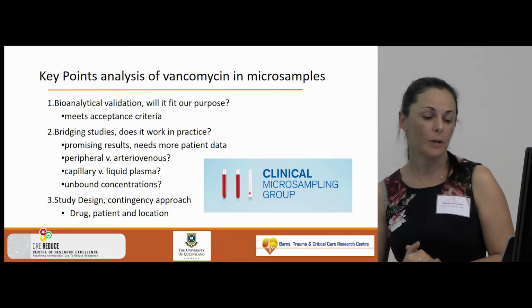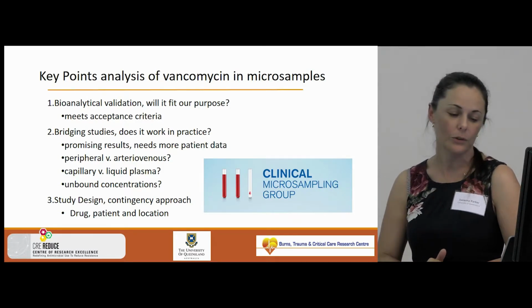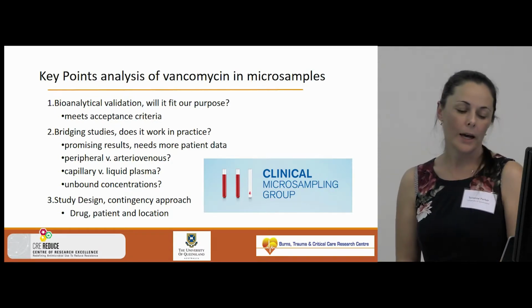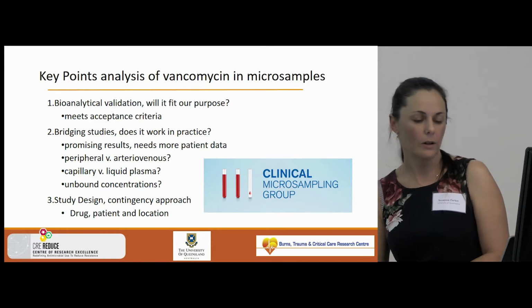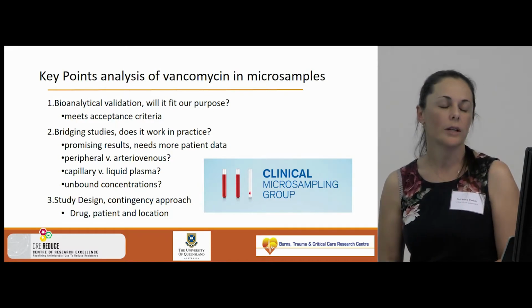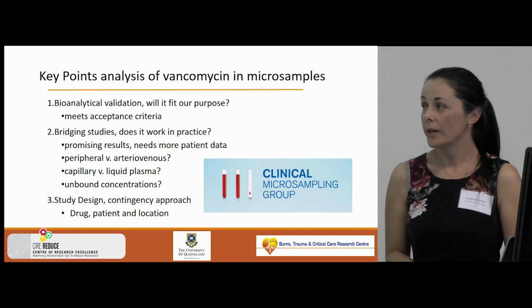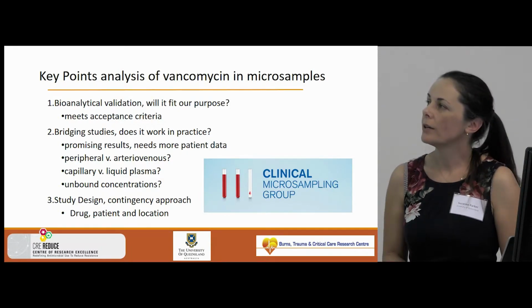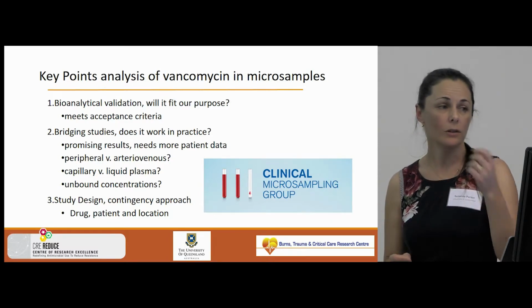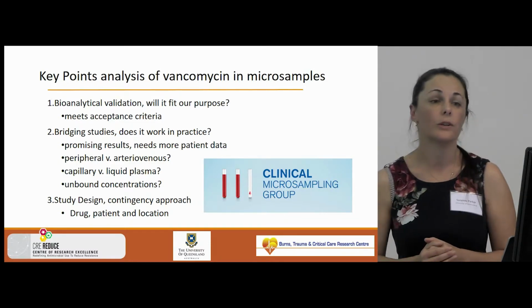We're wary about where we go because we do know that to dose vancomycin in critically ill children effectively, we need data on unbound concentrations. The same study by de Kock just recently suggested that we can correlate protein concentrations to our unbound levels. They provide us with a calculation to achieve it. And so I guess one of the questions is whether or not we can obtain this information of a protein concentration as part of our routine clinical practice.